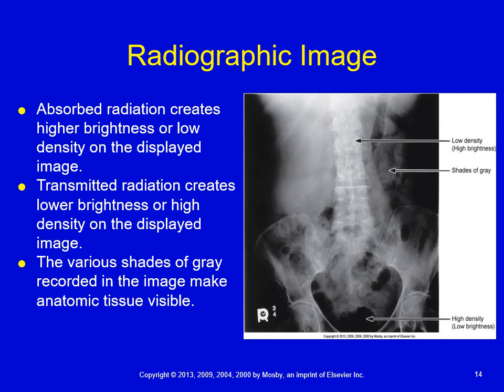All right, so now with this image, we want you to try to visually connect what we've talked about in the previous slides to what you're actually seeing on the X-ray. So remember, some of the X-rays will be absorbed by the patient. Some will pass through and reach the image receptor. Some will scatter, but we're not really talking about the scatter on this particular image.